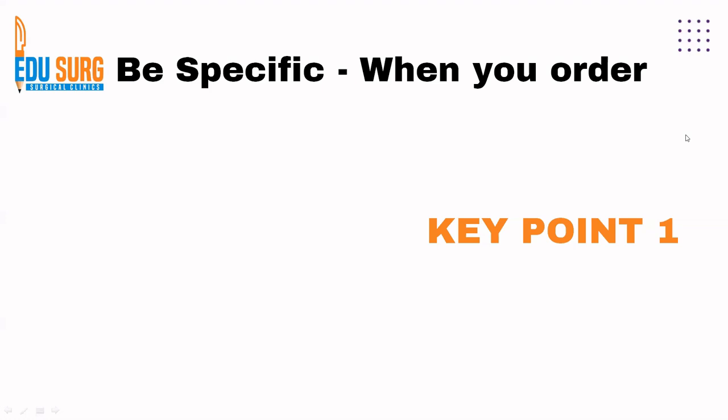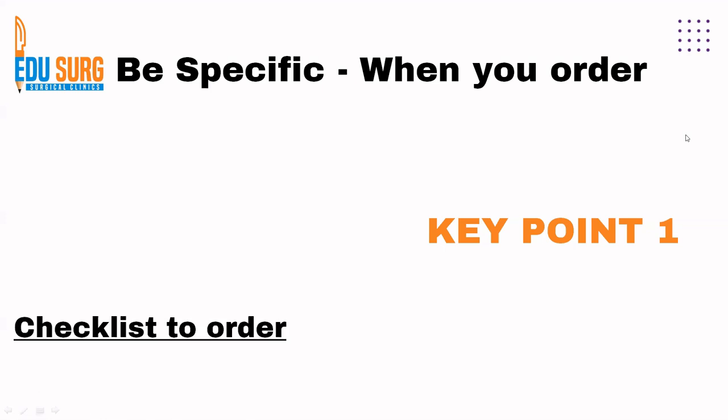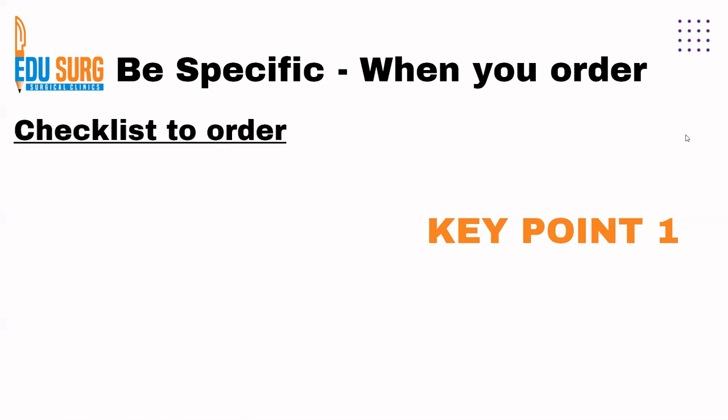Now remember that before seeing a scan, a very important point is ordering a scan, okay? Because your patient is going to rely on you for giving a proper prescription. This is a very important point, and that is why we are highlighting it as key point one. Be very specific when you order a CT scan. So we are providing you a simple checklist to order.